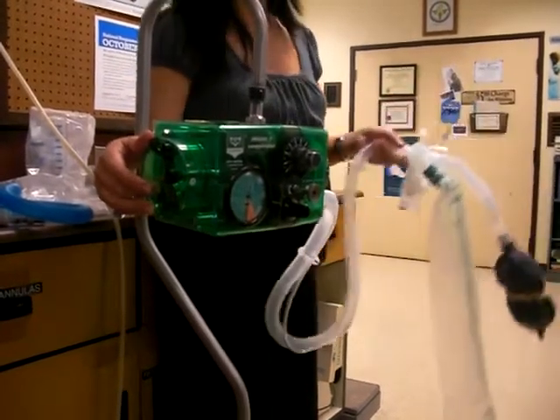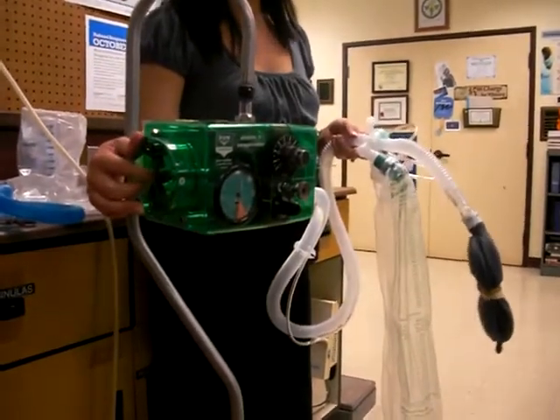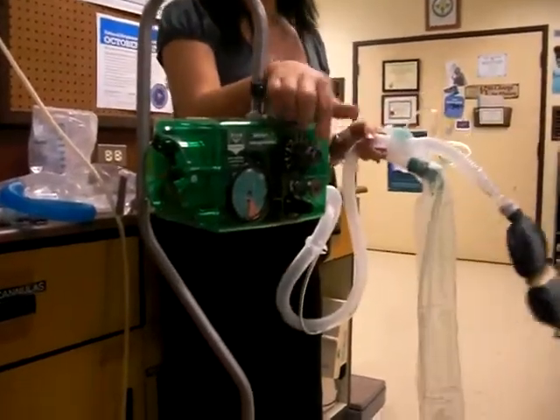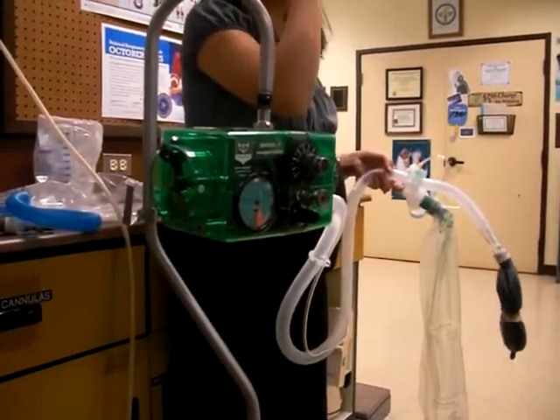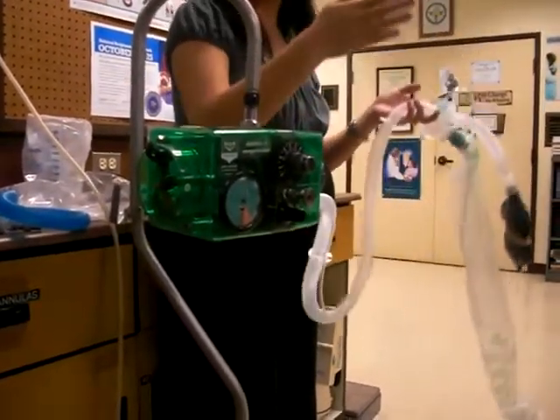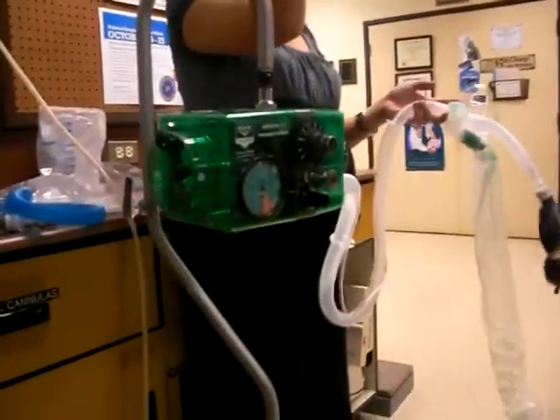There we go. So what happened to your I time when you went up on the pressure? It increases, right? So you don't increase your flow to get more volume. You increase your pressure, because as you increase your pressure, your I time should also extend, right? Because it takes longer to hit that pressure.